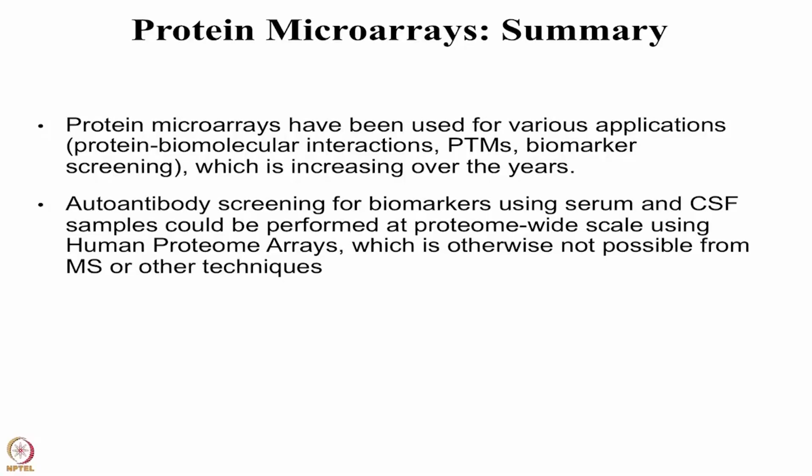Autoantibody screening definitely shows the power of using protein arrays. Directly from crude serum or CSF samples, we are able to screen this kind of autoantibody response, which is very close to clinical testing, and which is not possible using a very robust mass spectrometry-based platform.